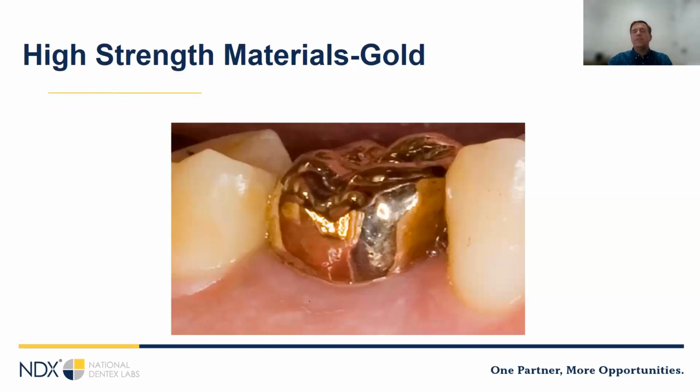Gold crowns. In some ways, I'm talking about a section, and you're like, what's with the gold crowns? But let's face it, a gold crown is durable, it's biocompatible, it's very easy on opposing dentition. Really, the only thing that's wrong with a gold crown is it's expensive and ugly. So there are going to be some patients where this is the best restoration for their second molars. If you get a patient that says, I don't want this to break, and you see when you prep the teeth, they were all flat, might be a good case to put some gold crowns in there.